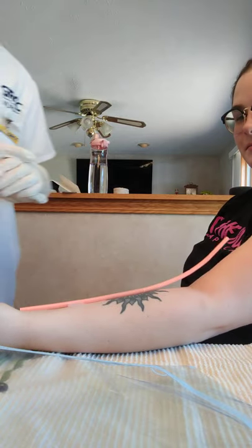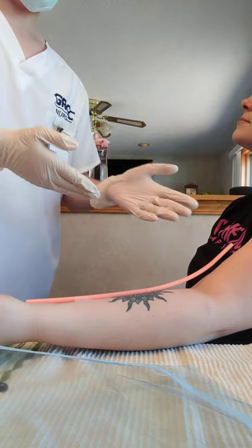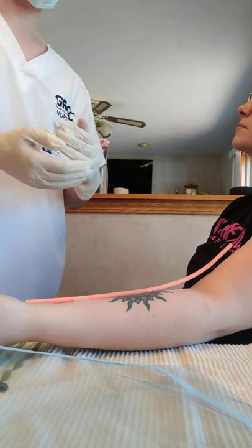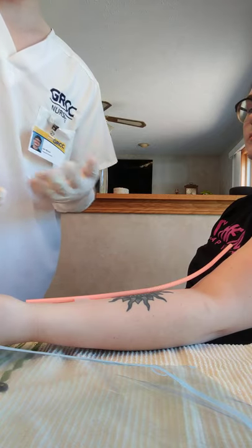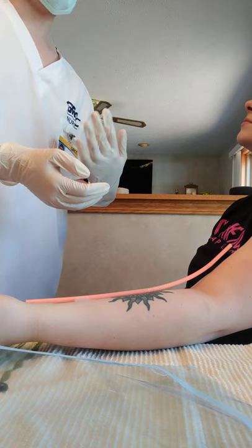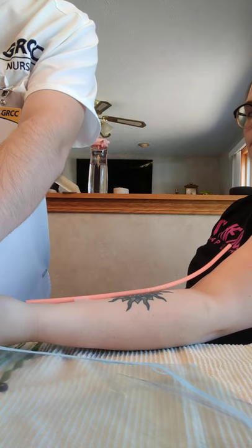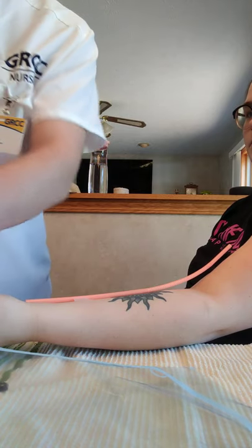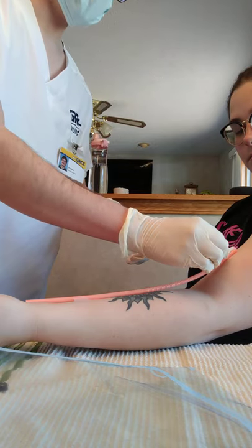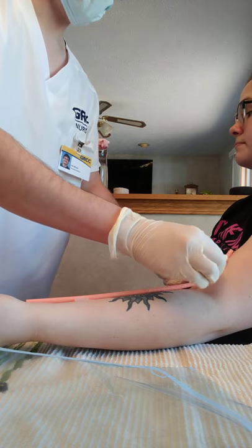And now I'm going to clean the catheter site. If it was dirty, I could use soap and water to clean it first, but it appears to be clean, so I'm going to use a chlorhexidine solution. If chlorhexidine was contraindicated, then I could use an iodine or iodophor or alcohol solution. I'm going to take this chlorhexidine swab and swab the catheter site for about 30 seconds.